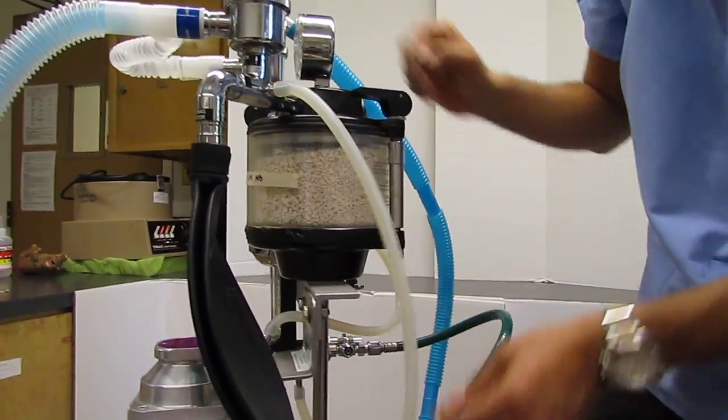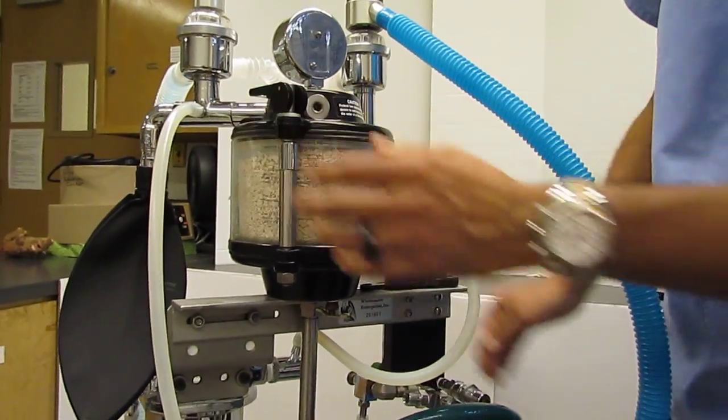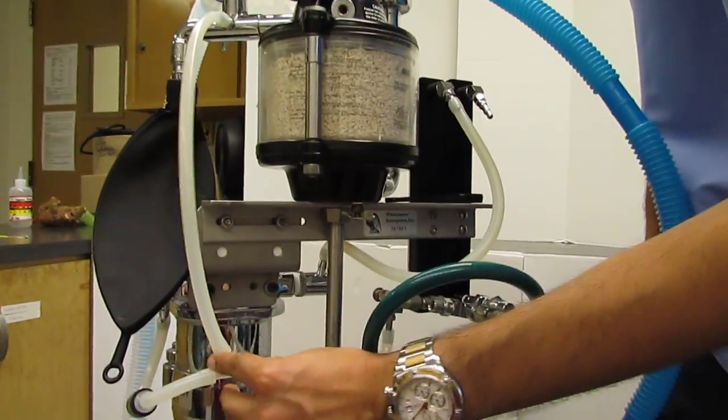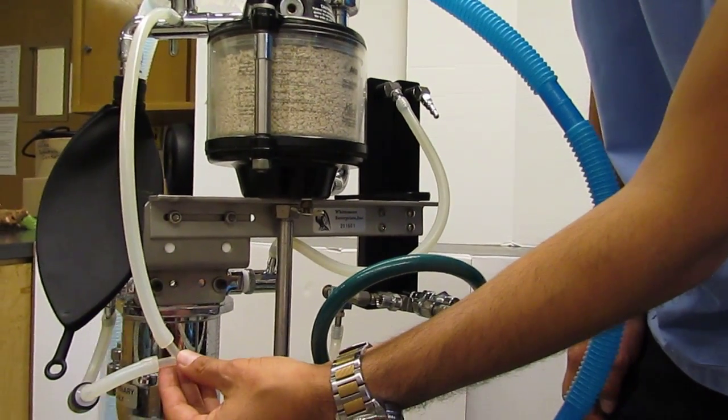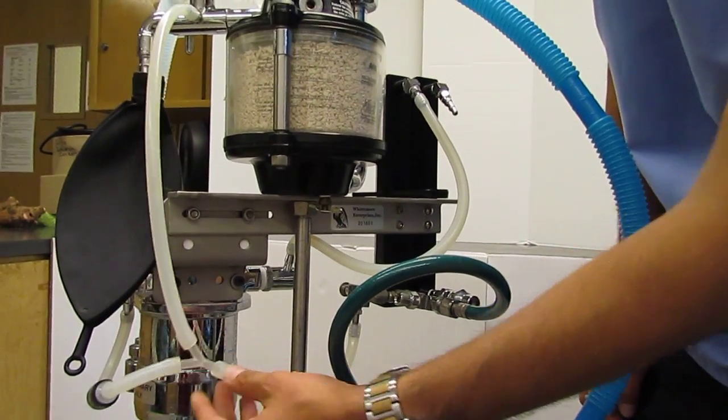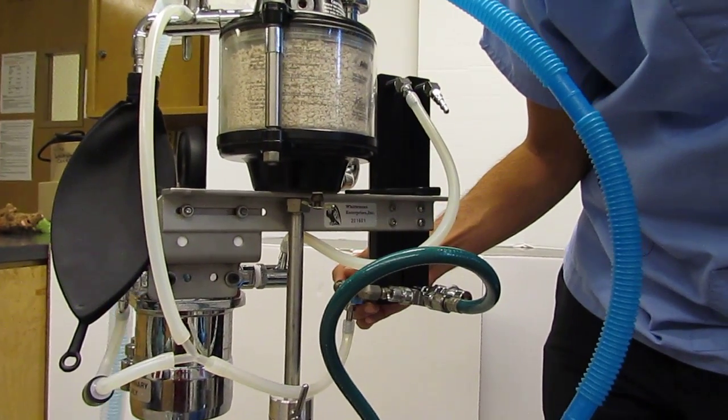Now, you'll notice back here as well, while we're back here, we're going to talk about the O2 bypass. So, you'll notice here we have a little Y connector, and there's another circuit that's coming into this. The reason there's another circuit that's coming into this is because, if you remember, that was our O2 bypass.